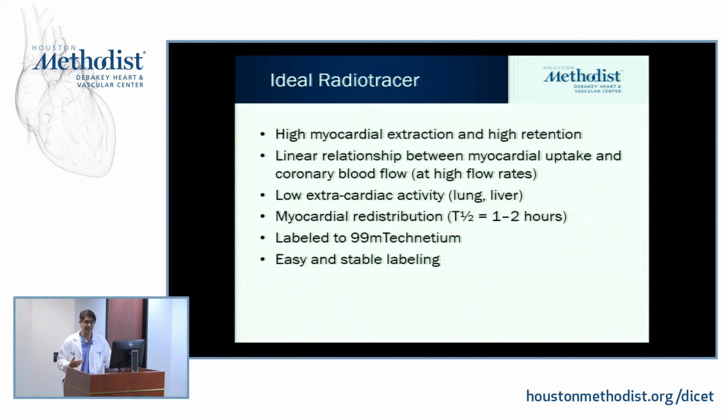Technetium for us is a very simple agent to use, and it's got very high count activity. So if we could label it to tech, that would be good. And for preparation's sake and being able to administer to our patients, if it could be easily prepared and labeled, that would be helpful as well.